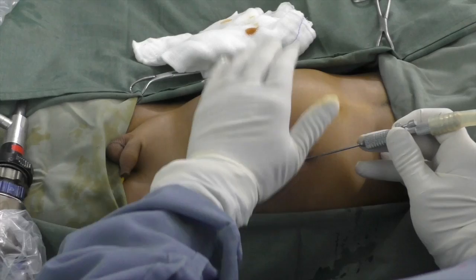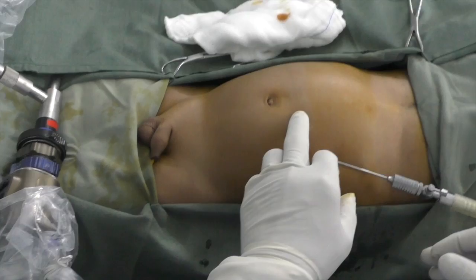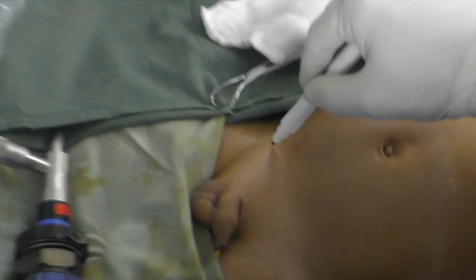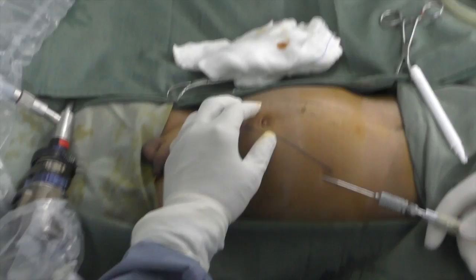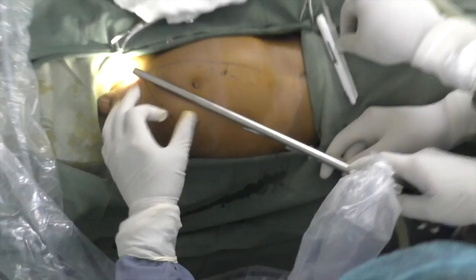There should not be any problem in the creation of the pneumoperitoneum. Now insertion of the 5 mm or 10 mm port depending on the camera you have. I usually put the port two finger-breadths above and away from the side of the operation. We are operating on the right side. Above the umbilicus is always better a little bit; otherwise in a small abdomen below umbilicus the camera will directly come into the space. When you put the camera, usually it should be half — that is the principle.